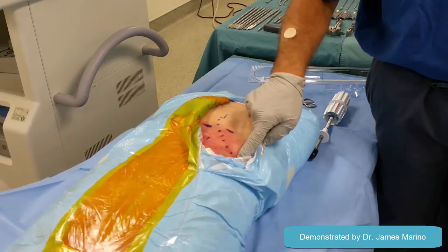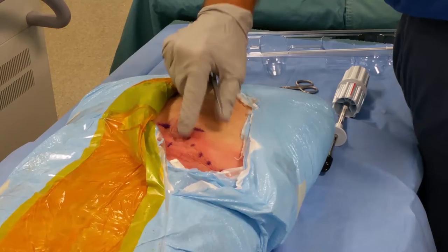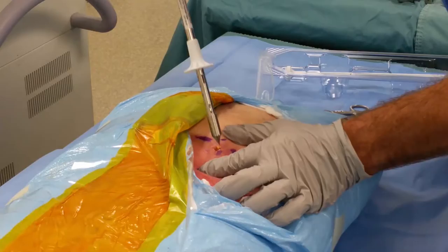On this cadaver, which I've just basically outlined, the iliac crest, here's the midline obviously, gluteal crease right here. It's easy to palpate, kind of a bulbous enlargement here. You don't really need fluoro, but this is the posterior superior iliac spine right here.